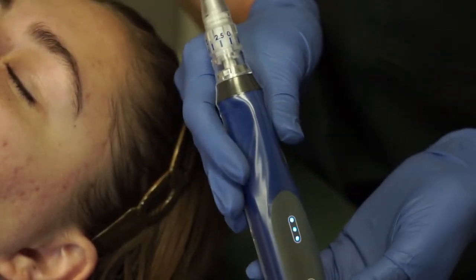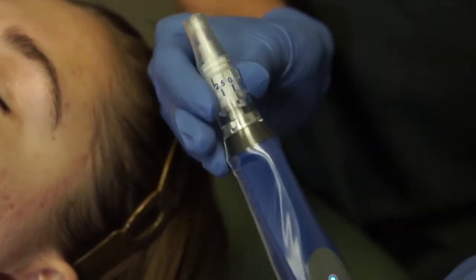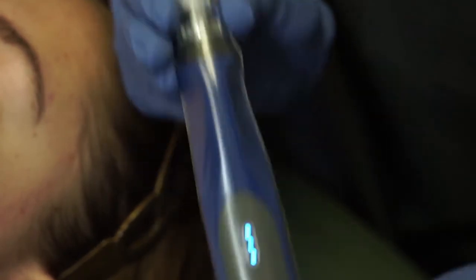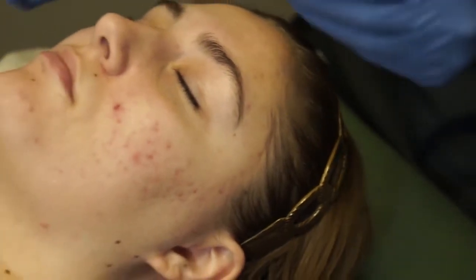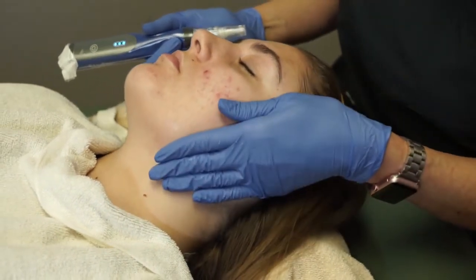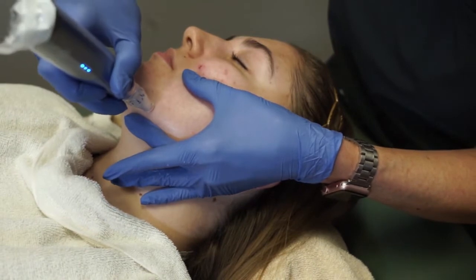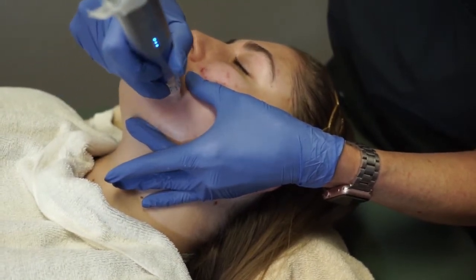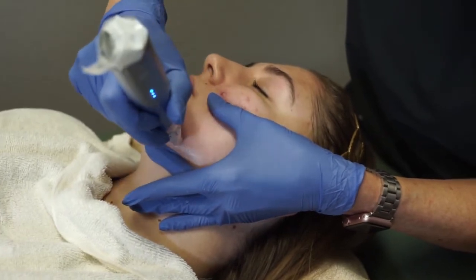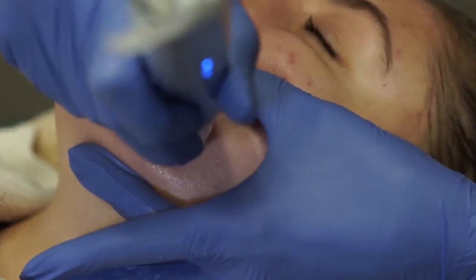Start at a depth setting of 0.25 mm and increase in increments of 0.25 mm or 0.5 mm until desired erythema is reached, with a maximum depth of 1.5 mm on the face. Stretch the skin taut and begin moving the device slowly in controlled horizontal and vertical motions, with the tip of the cartridge completely flush with the skin to ensure consistency in needle penetration.